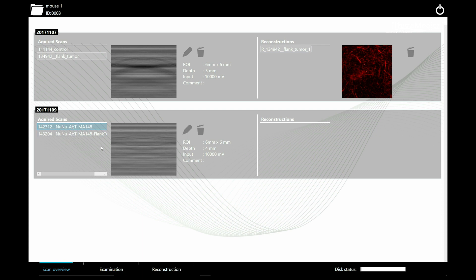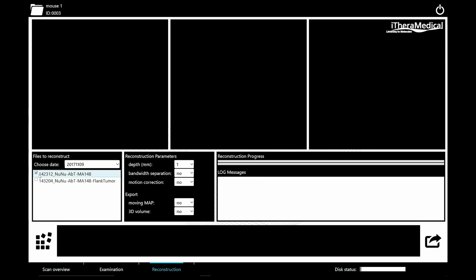By clicking on a selected preview image, the Reconstruction tab is opened. The Reconstruction tab allows the selection of files to be reconstructed, as well as the selection of the imaging depth.